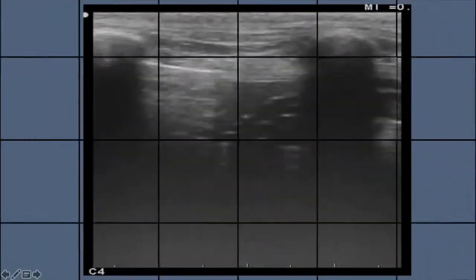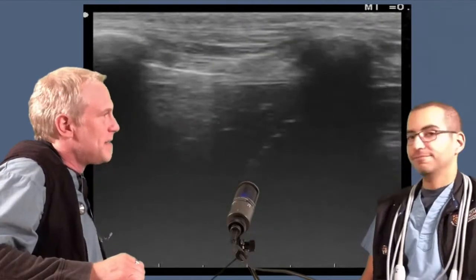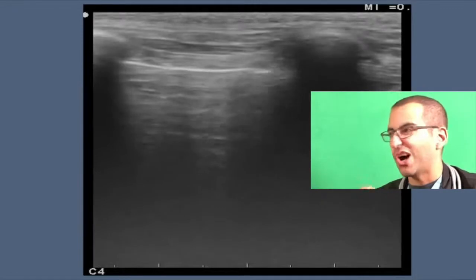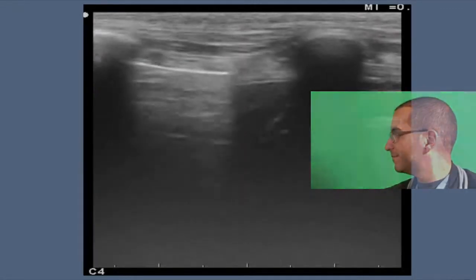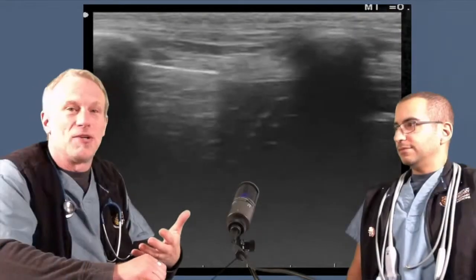Curtain? When an animal breathes in, which direction, cranial or caudally, if we have the marker cranially, does the diaphragm move? It moves caudally. Exactly. So on inspiration, we see this caudal movement of this vertical line, and that is our curtain sign. Important to identify because we don't want to mistake it for pathology.